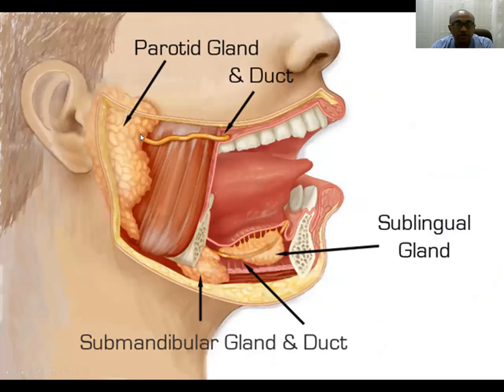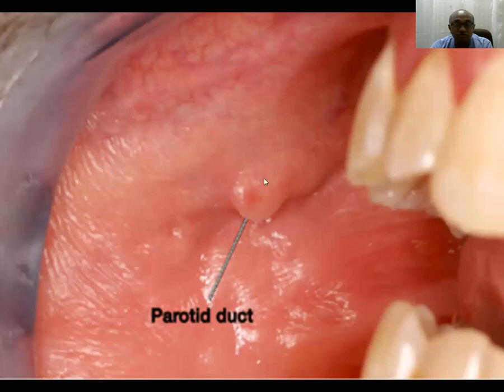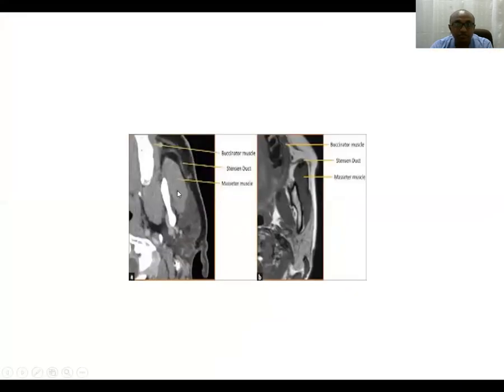Another important part is the parotid duct, also known as Stensen's duct. It emerges from the anterior part of the parotid, goes superficial to the masseter muscle, appears at the buccinator muscle, and opens into the buccal mucosa opposite to the upper second molar tooth. You can see the opening of the parotid duct here, the masseter muscle, and the parotid gland. This is Stensen's duct, otherwise known as the parotid duct.